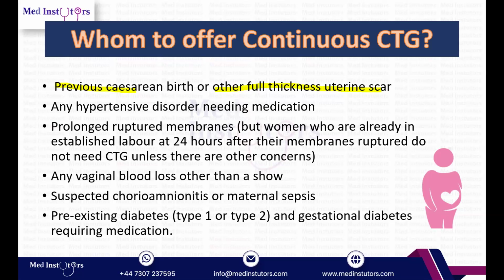Why would we offer continuous CTG? Correct. Rupture of scar or dehiscence of scar. And how would it present on the CTG? Fetal distress. Correct. There would be bradycardia, and that's the first sign of scar rupture or scar dehiscence on the CTG.